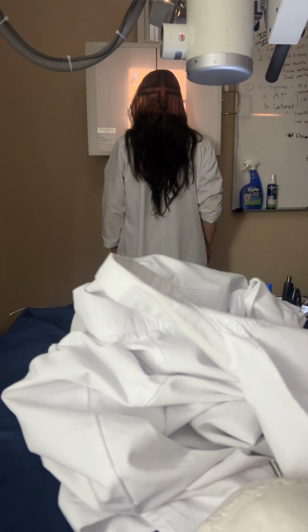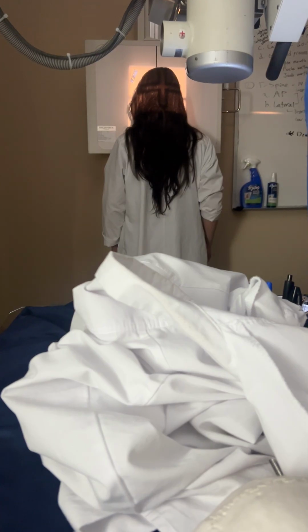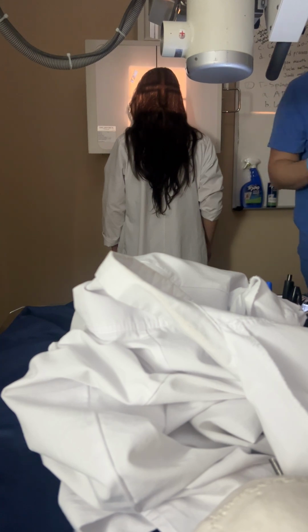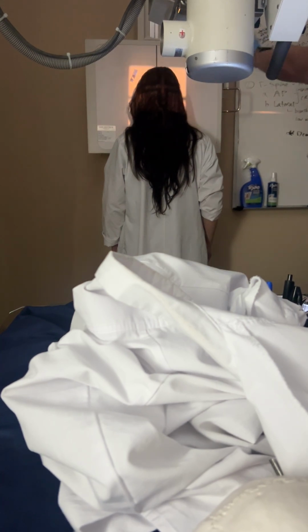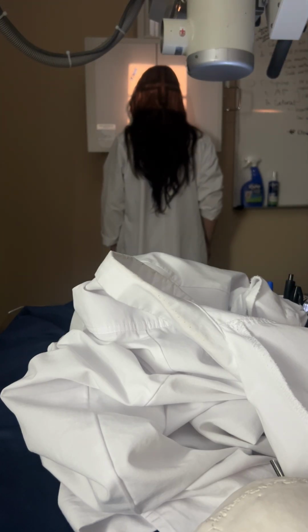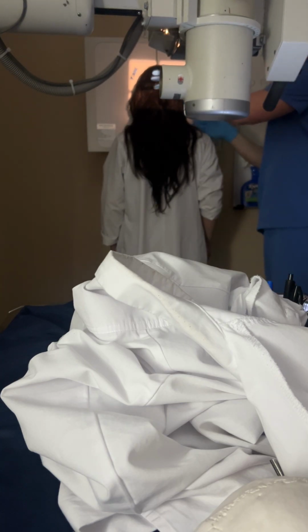PA Caldwell skull. The difference between the skull and the facial bones is your collimation. Caldwell for the sinuses, very important difference. You don't angle the CR. Why? Because you want to accurately evaluate air fluid levels in the sinuses. So you angle the patient, you don't angle the tube. Your tube stays perpendicular, but you still have 15 degrees somewhere. You put it in the patient. So the 15 degrees is the patient's. 15 degrees for the skull, 15 degrees caudad angulation for the facial bones, not for the sinuses. You keep your CR perpendicular and you add it to the patient.